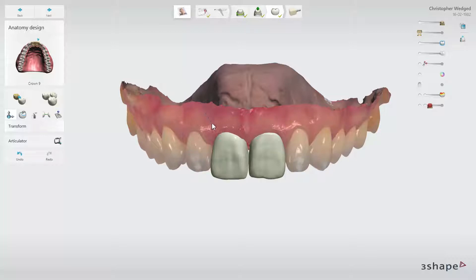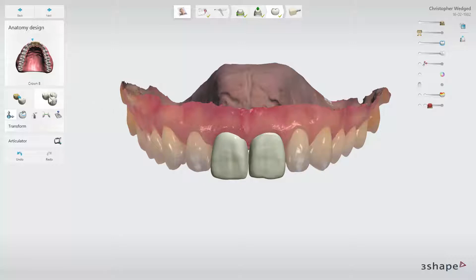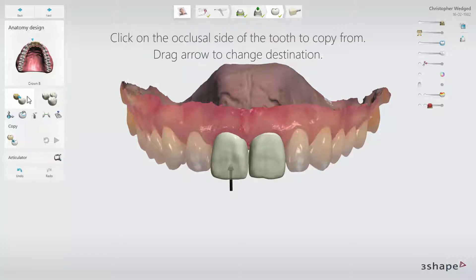To do that, first choose the tooth on which you would like to copy your design. In our case, it is tooth number 8. Click on the Copy tool. Now you will be prompted to click on the occlusal surface of the tooth that you wish to copy — it is tooth number 9 in our case.